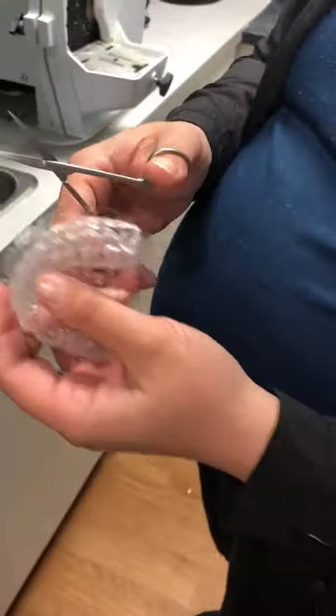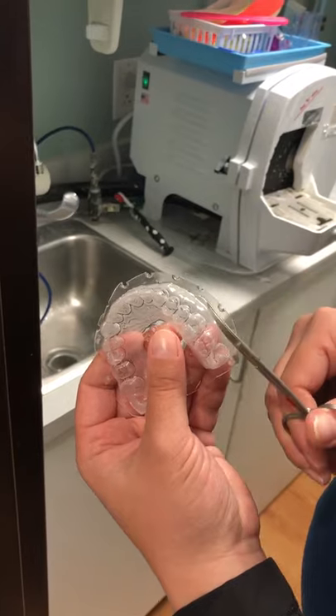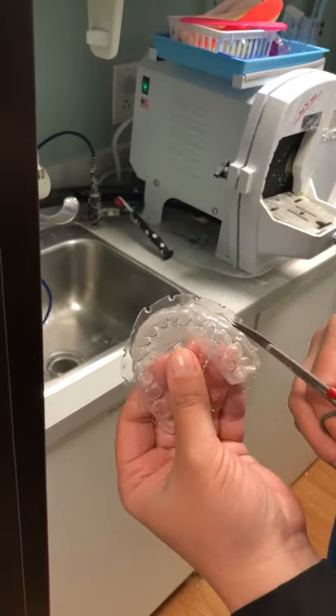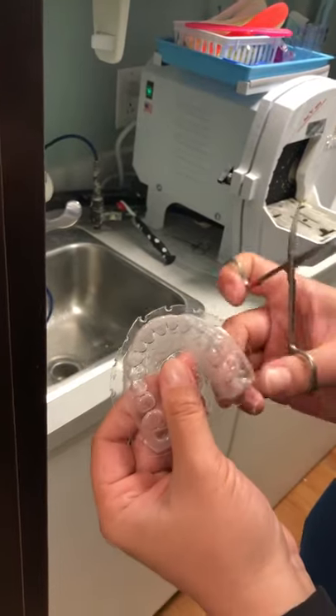Now when you go to trim, your scissors are actually gonna face out — your points here. You would think of them kind of tilting in slightly, but in this case we're gonna face them out. So what you want to do, you want to come up.